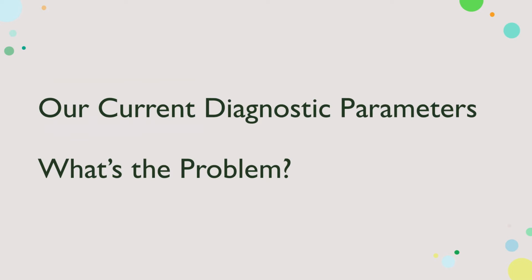Okay, so now we're going to go over our current diagnostic parameters. Why am I here? What is the problem? Well, I got a phone call from the renal transplant surgery team a few months ago, and they expressed concerns over our reporting. There are so many of us and so many patients and so many exams being done that there has been a lot of inconsistency with how they're being reported, the numbers that people are using, and what we're recommending. And so this is where all of this stemmed from.